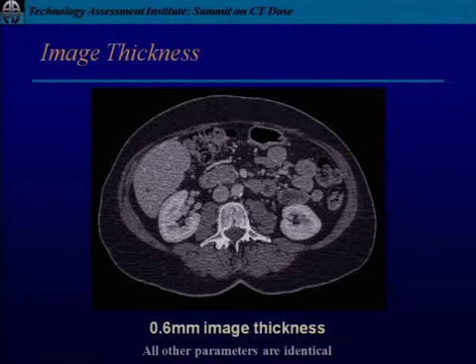And now you can see we're getting to a point where the image noise is really starting to overwhelm things. And you can imagine if we went a little bit thinner or hadn't used quite as many photons as this, we would lose that object again in the noise. Okay, so clearly the answer lies somewhere in between. Again, we need to target what we are doing to what we are trying to see.